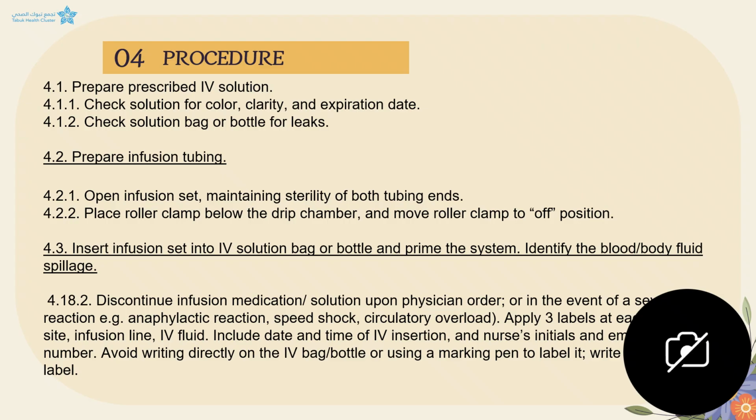Okay, then you will discontinue the infusion medication solution upon physician order or in the event of severe reaction, anaphylactic reaction, speed shock, circulatory overload. You will apply 3 labels to each area: IV site, infusion line, and IV fluid, including the date and time of insertion, and the nurse initials and the employee number, avoiding writing directly on an IV bag or bottle or using a marker pen to label it. Write only on the label. Okay?